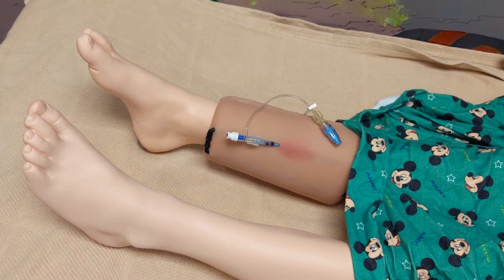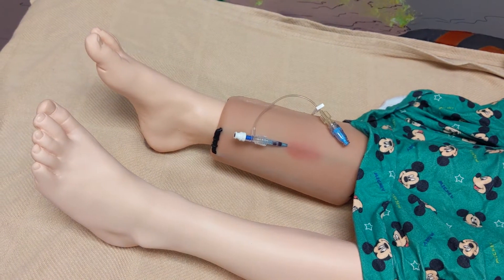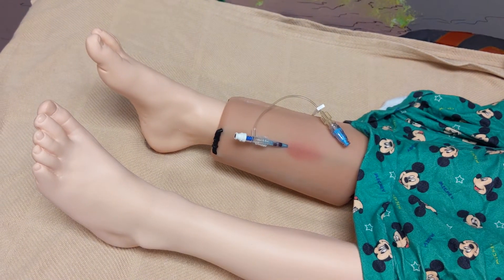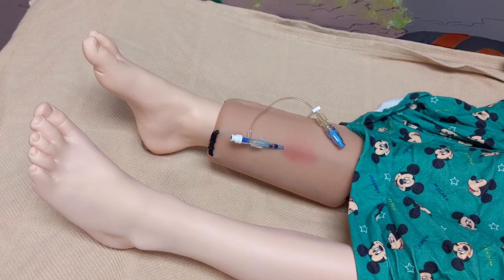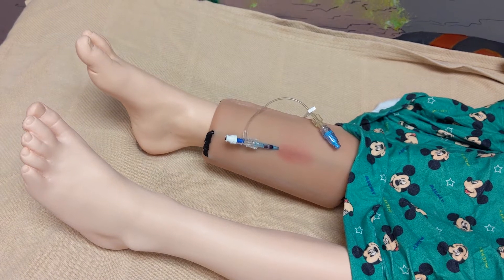Before I remove the PIV, I'm going to refer to my institution's policy and formulary to make sure that it's okay to remove the IV. Now I'm going to remove the IV.